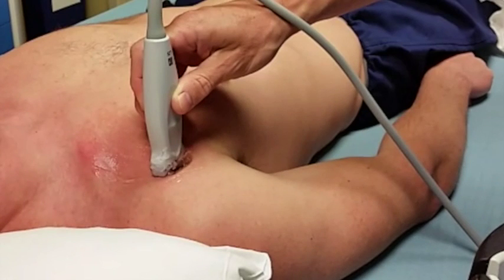Using standard sterile prep and technique, including an ultrasound probe cover which I am not demonstrating here, locate the axillary artery and vein in the very lateral chest near the shoulder.